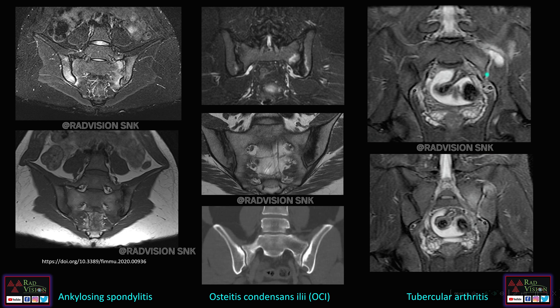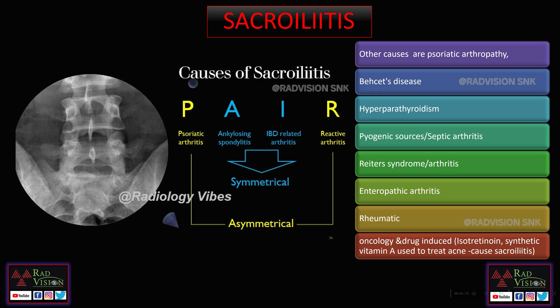The third case shows unilateral involvement of the left SI joint with collection within the SI joint space and even in the adjacent soft tissues. This was a case of tubercular arthritis involving the left SI joint. So these are three different sacroiliitis presentations with different pathologies but similar imaging appearances. Next is a useful mnemonic framed by Dr. Sandeep Awal from Radiology Vibes.